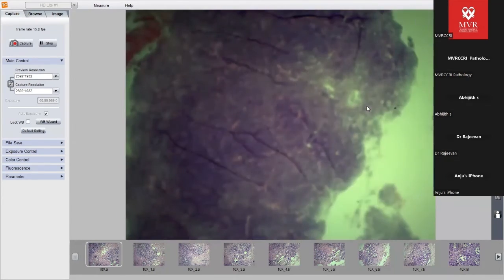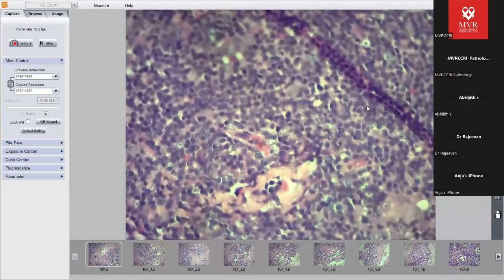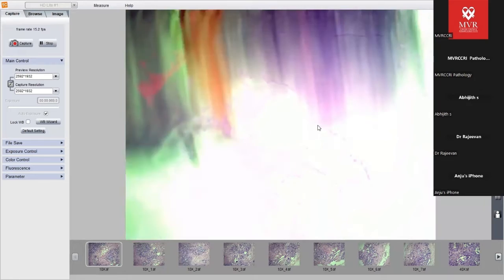In a reactive background. How was the background? The background was not mixed. It was lymphocyte rich. I don't see any neutrophils, don't see any eosinophils, it is not very pink. That means not much histiocytes. It is blue. A lymphocyte rich background with scattered large cells.